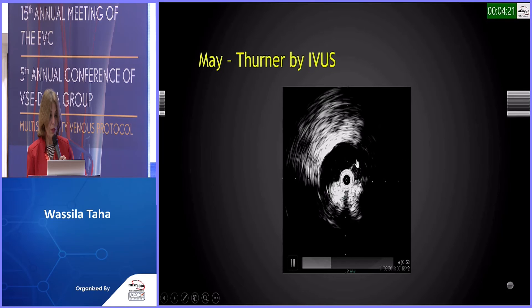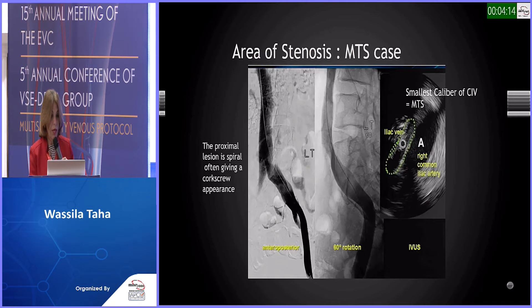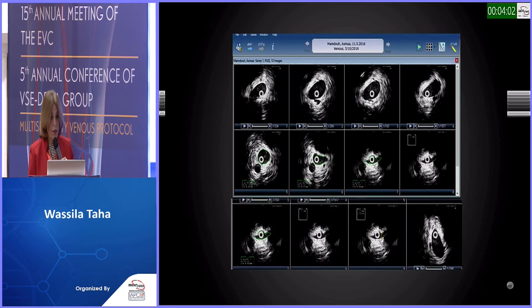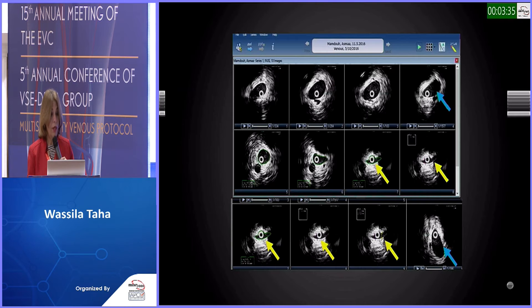On IVUS pullback, we see the presence of a very attenuated and stenotic left common iliac vein. This is the correlation between the IVUS stenotic lesion of the proximal left common iliac vein and the corkscrew appearance on venography. The axial cuts of the IVUS are very informative: yellow arrows point to tight stenotic lesions at different levels, while blue arrows point to the proximal and distal healthy segments. This confirms the diagnosis — yes, there is a stenotic lesion at the proximal left common iliac vein.